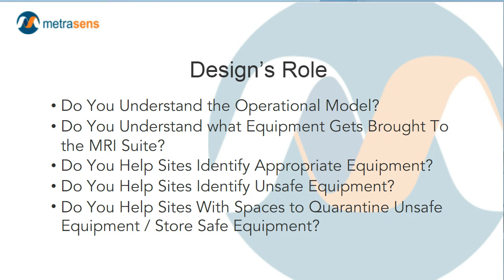What do we need to make sure of from a safety standpoint that is happening, or things that we prevent from happening, to make sure that we protect the safety of the patient and the caregivers? Do we understand what equipment gets brought to the MRI suite, and whether that's safe to continue all the way into the room with the MRI scanner, or whether we need to look at making swaps and substitutions like with our walker?